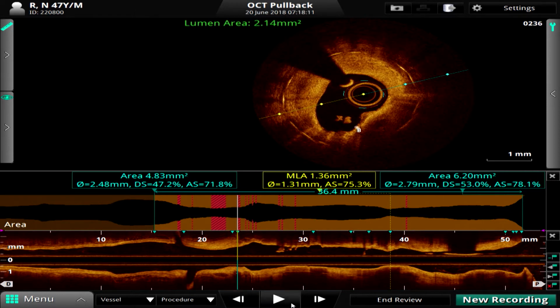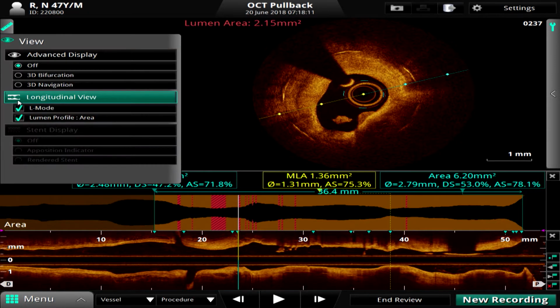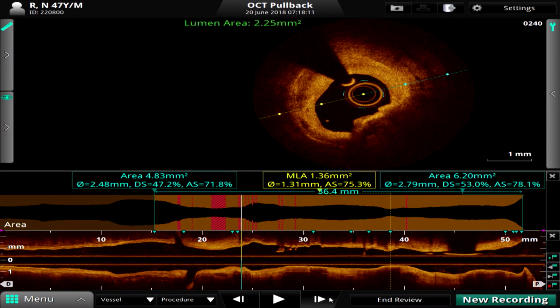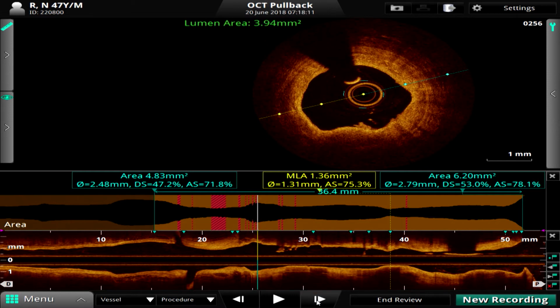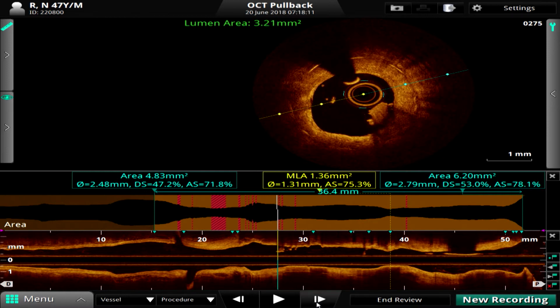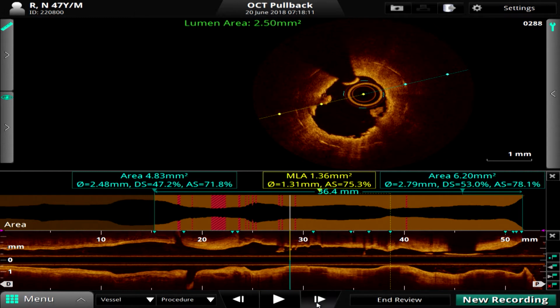Yes. You can see a very thin cap fibroatheroma in the neointima around 5 to 6 o'clock. The measurement was only about 50 to 60 microns thick. And just as you come up, can you show, there is a classical fibrous cap discontinuity, the classical plaque rupture with continuity between the lumen and the lipid pool. And of course, lots of clots there, some mixed clots, most of it is white clots. Go back, you can see the fibrous cap discontinuity, the classical plaque rupture.